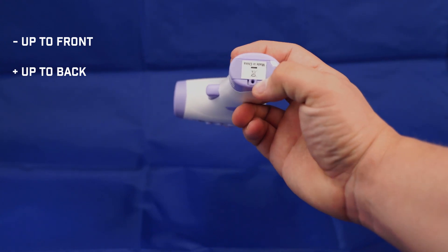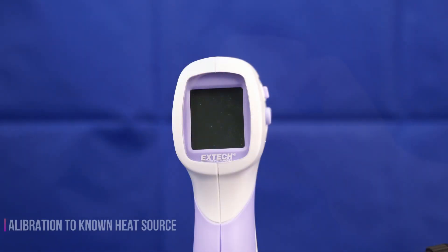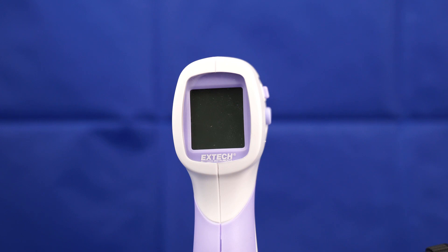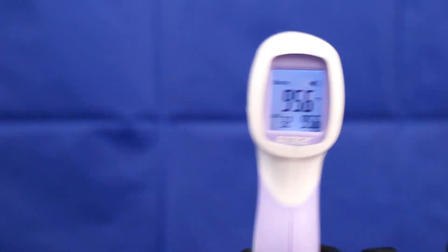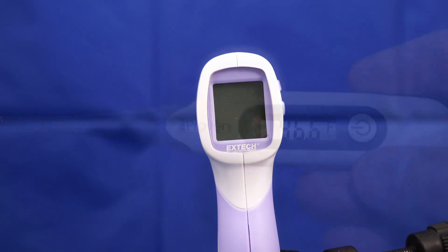There is a screw here if you would like to lock in the battery door. The first step of the calibration process is to take an initial temperature with the XTEC IR200 and see what the reading is — we have a 95.6 reading.